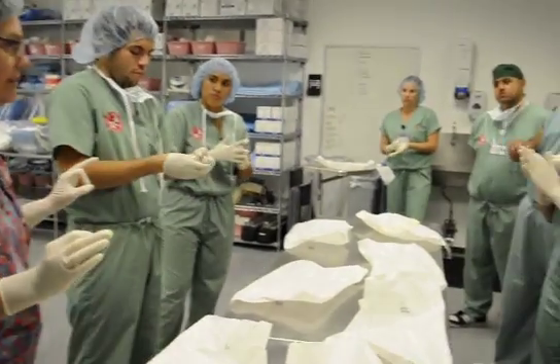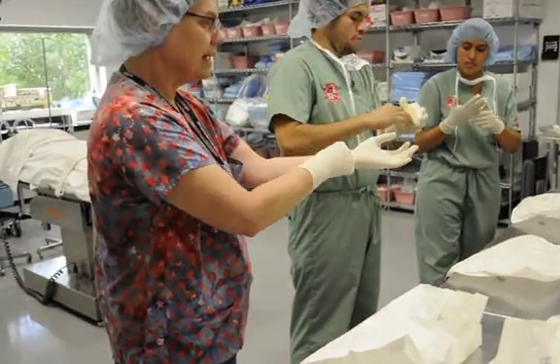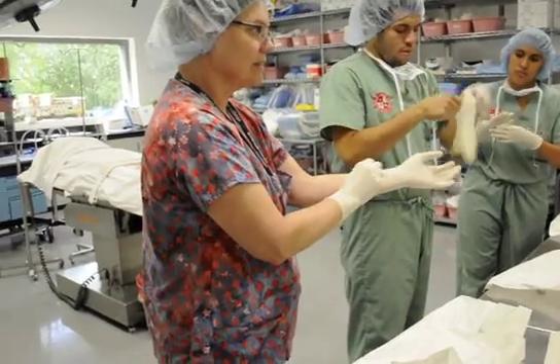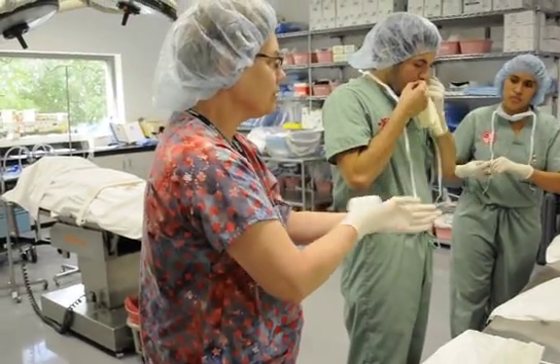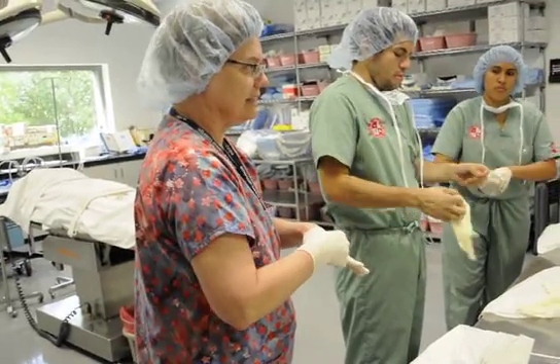This becomes much harder when you have a gown on, because when you go to pull this up, you can't be touching your gown. That's where most people run into trouble — when you put the gown on.